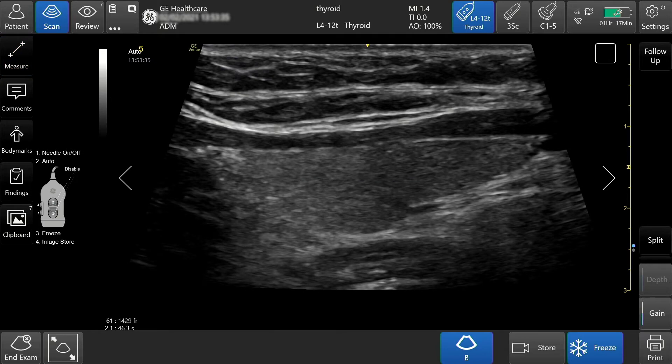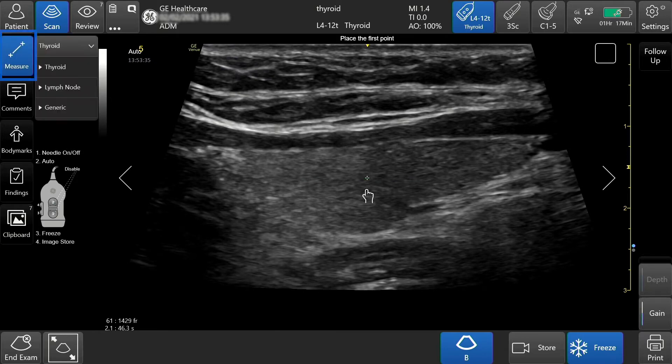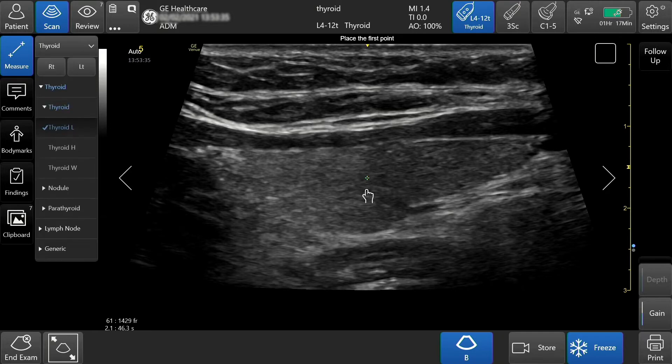To add a measurement into the calc package, tap the measure tab. Select the measurement that you would like to complete. In this case, I will measure the thyroid length.